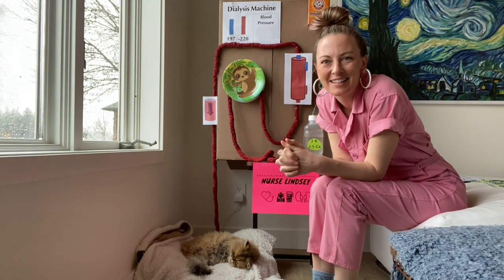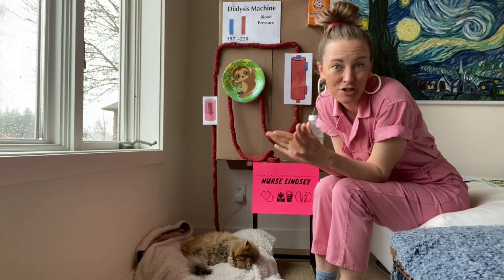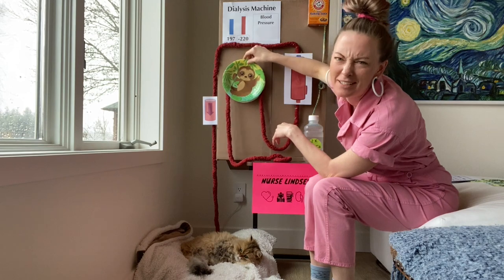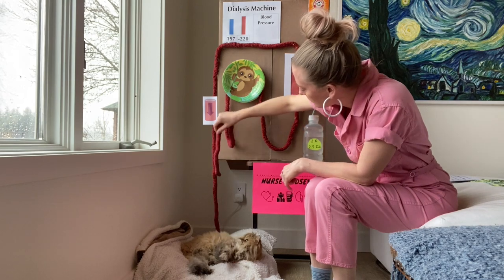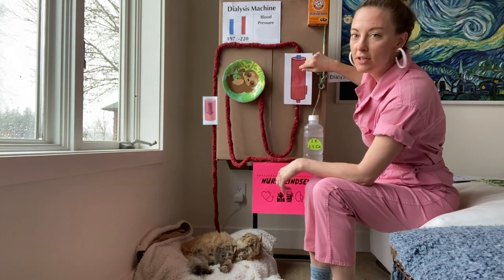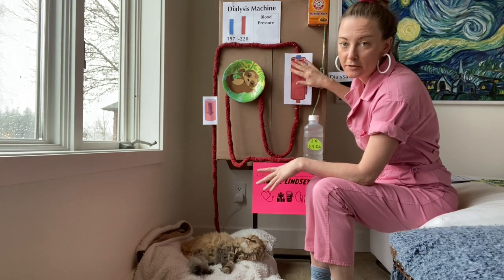I was up late last night putting this machine model together and I want to give you a brief tour. We've got a sloth here — the pump is definitely faster than a sloth, but he's cute. First, we remove the blood from the patient, send it through the pump, then send it up through the dialyzer where all the magic happens — where the diffusion and ultrafiltration occur — and then send the blood back to the patient.